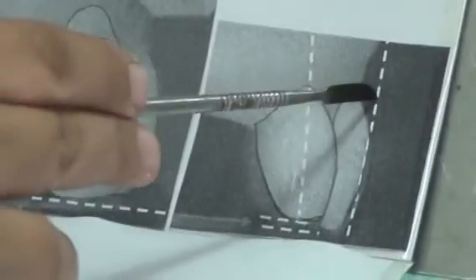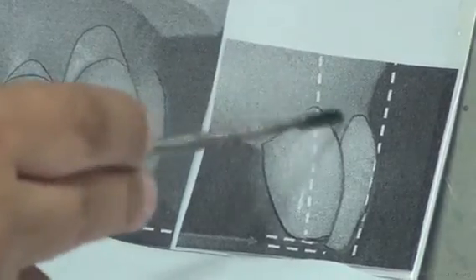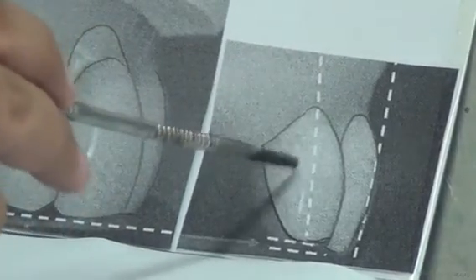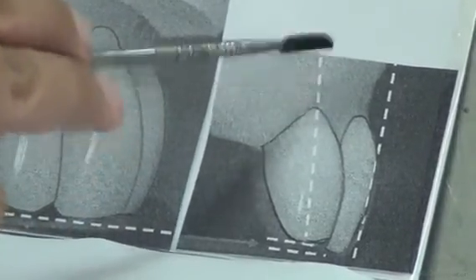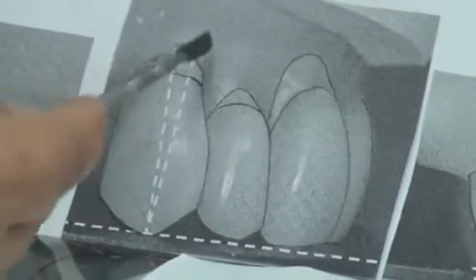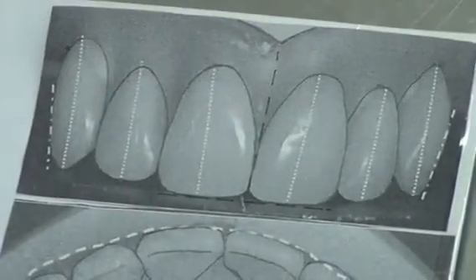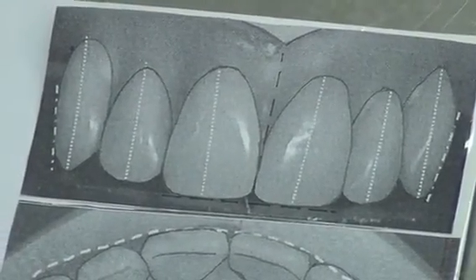So this is the central. This is the lateral, even more inclined. We're talking about the root, not the long axis here. We're looking at the proximal view, and this is the root position, and the root is depressed more. And once we place the canine in, we make it prominent. And if we look at it from the frontal view, we have this prominence of the canine. So this is how we judge your work.